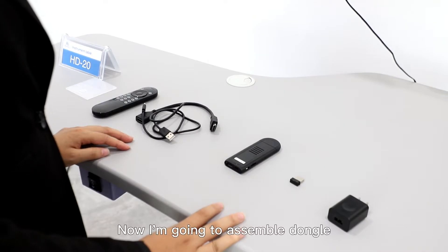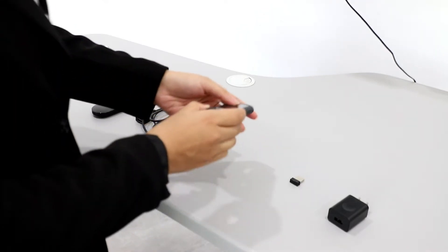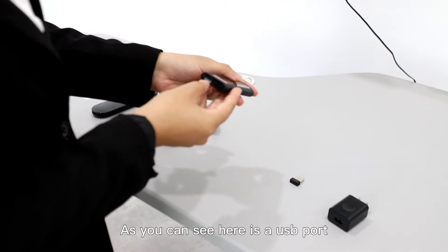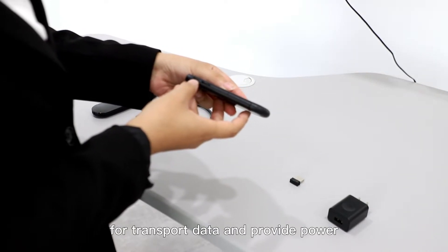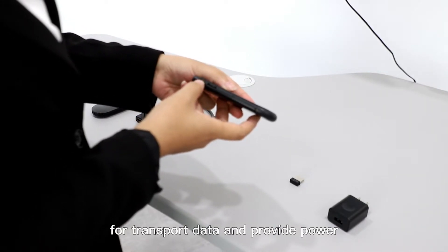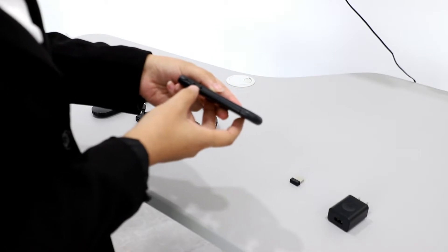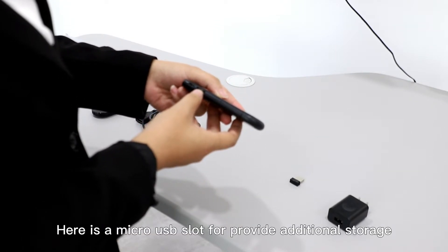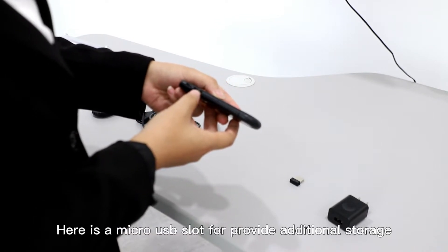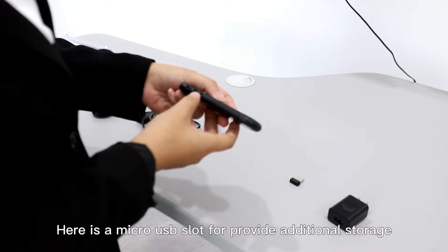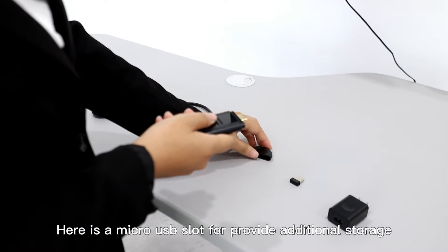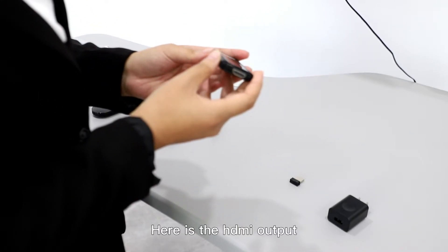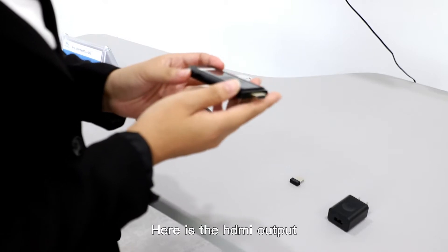Now I'm going to assemble the dongle. As you can see, here is a USB port, micro USB port for transport data and provide power. Here is a micro SD slot to provide additional storage. Here is the HDMI output.